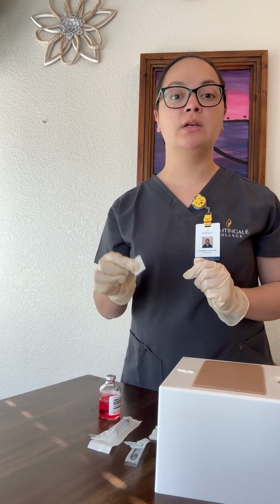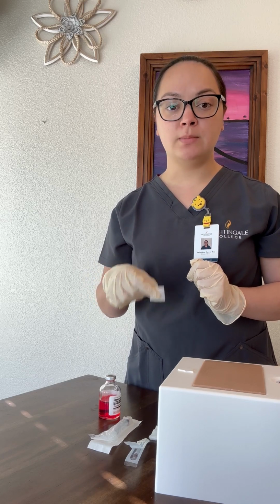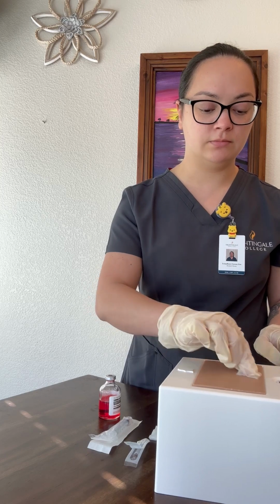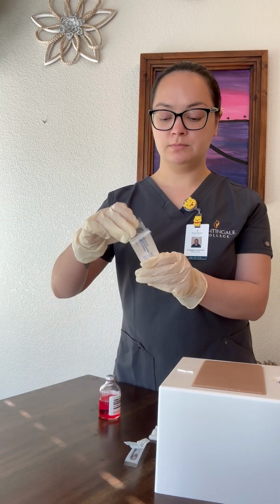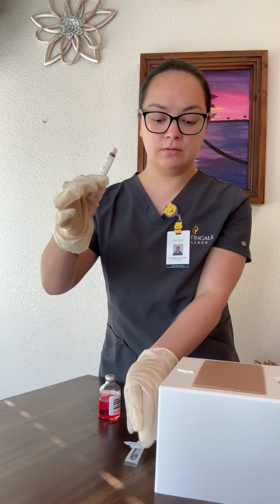Now we can also cleanse our site. We're going to work in a circular motion from inside outwards for a 5 centimeter radius. Discard. So now we will go ahead and attach our syringe to the needle.